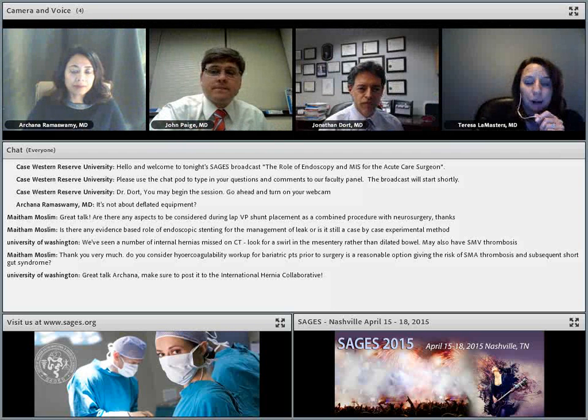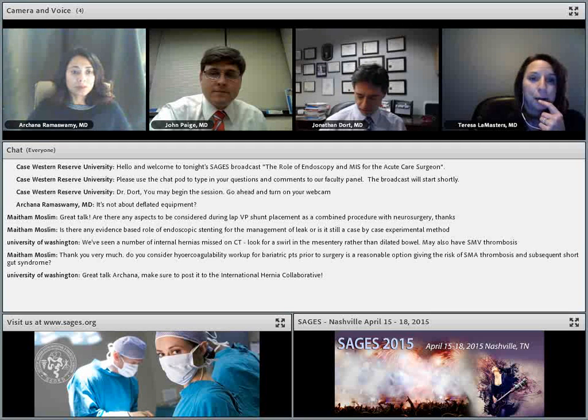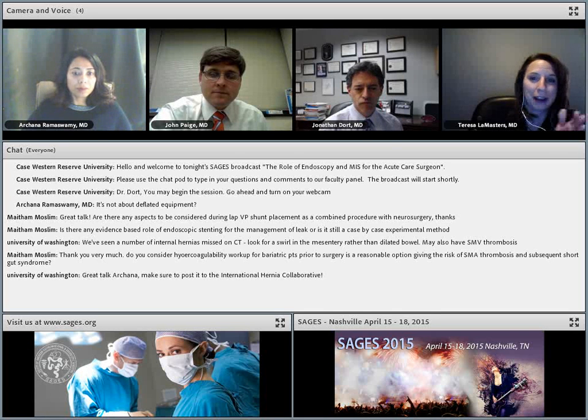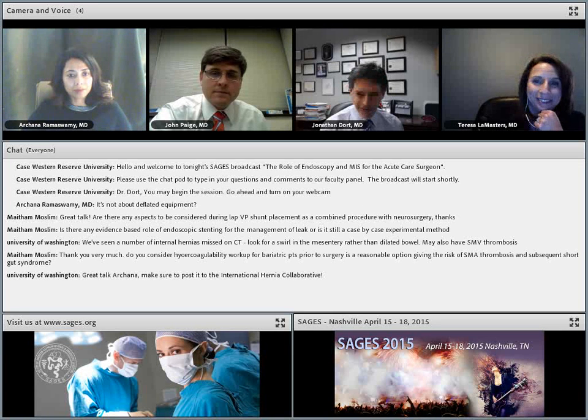About if you're not making progress, change positions. I think that's a great recommendation, especially for small bowel obstruction. You can get very focused on one area, and if you simply go to another area and come back, it can be much easier. So I agree 100% with your discussion there. Well, thank you. I think that's an important part.